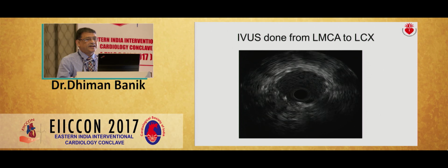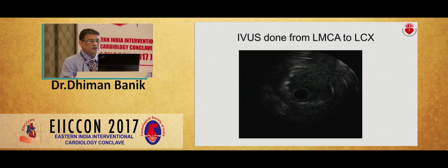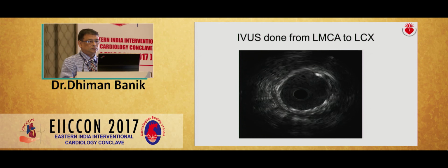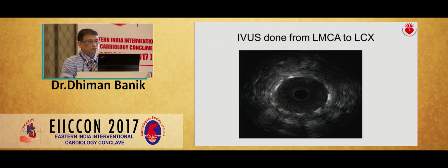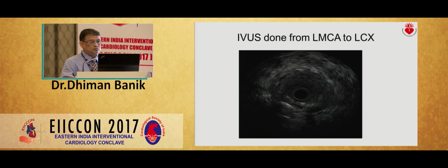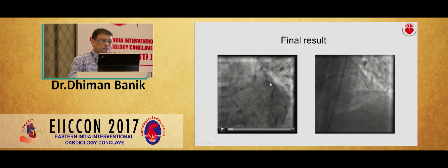Then I did an IVUS again from left main to LCX. LCX stent is open and this is the bifurcation. This is the left main. So, this was the final view.